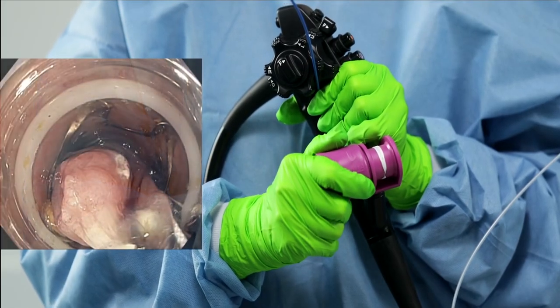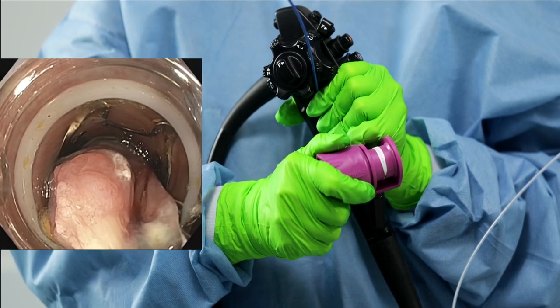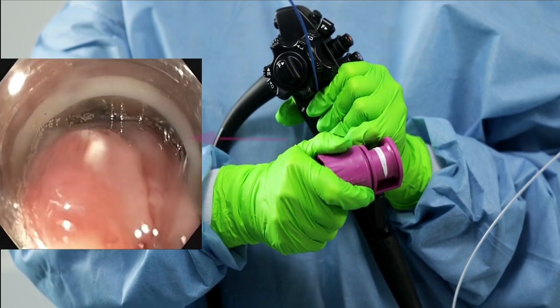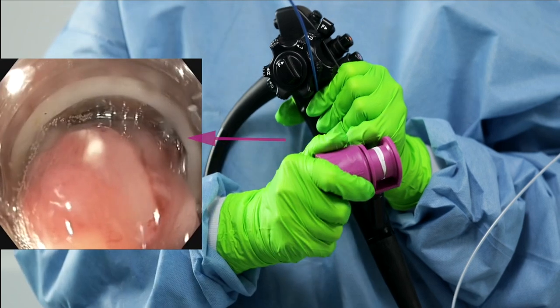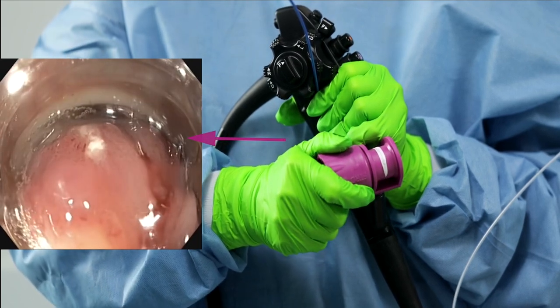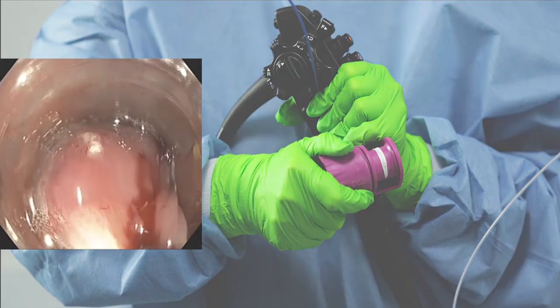Especially when the endoscope is twisted, for example in the colon, the hand wheel should be turned as far as possible. It may be necessary to reach back and turn it again, so that the force can be transmitted and the clip applied.